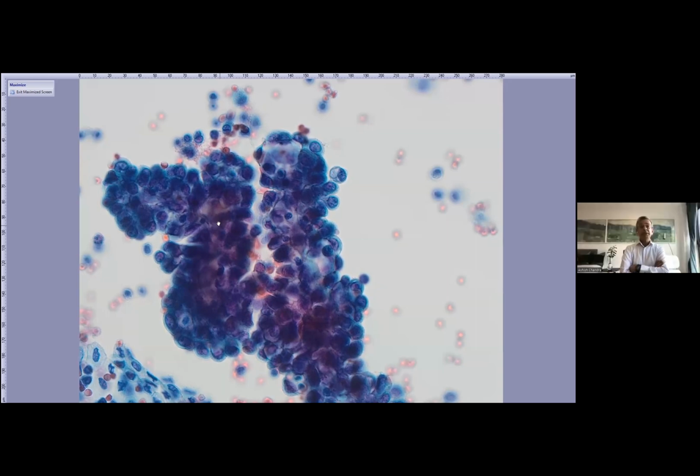Yeah, absolutely. I mean, that's another good point. In a clinical setting, absolutely, you don't have to duplicate your immunostains in the same department. Particularly with, say, pleural biopsies for mesothelioma, you've got a nice cellular pleural fluid, but there's also a biopsy. And it's really tempting to say, well, it'd be such a lovely case if I did the immunostains on the cell block.